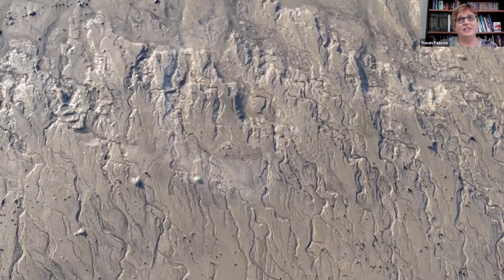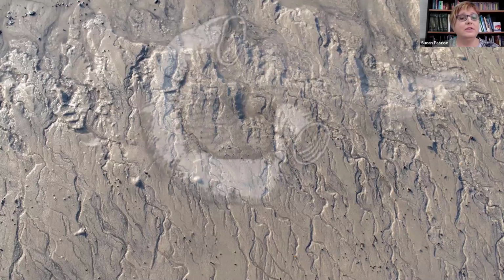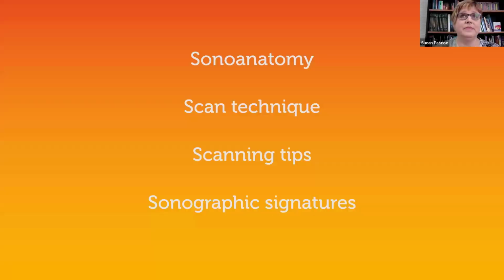So I think it's really important that first of all, you go with the things you know how to identify: where the aorta is and the SMA. If you can see aorta, SMA, you'll be able to see the splenic vein draping across the top, anterior to the superior mesenteric artery. And that helps you delineate where the pancreas is.